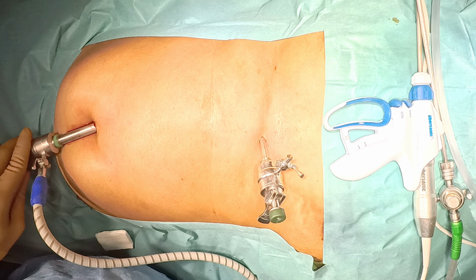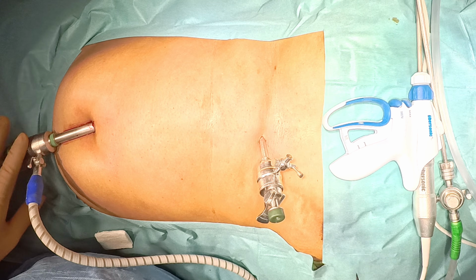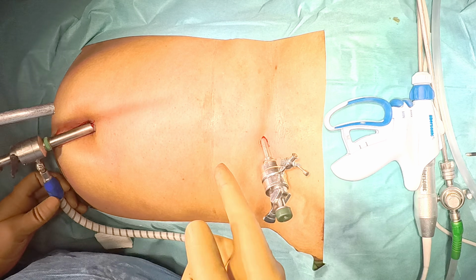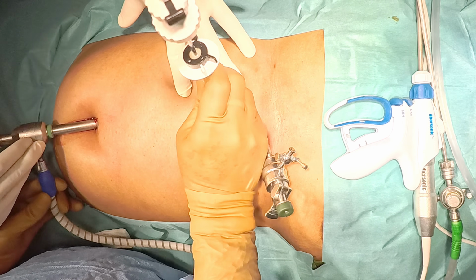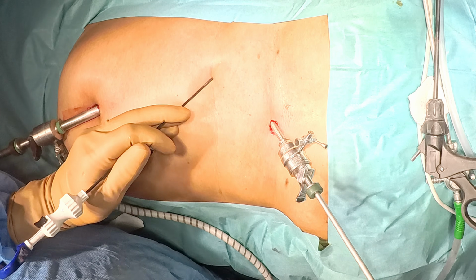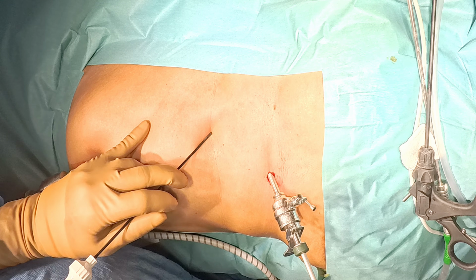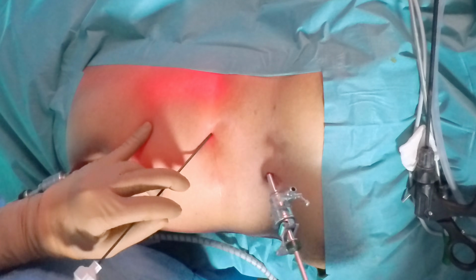So, this is diagnostic. Basically this third one is not a port, it is only a mini alligator. So, it is just a stab wound without any port. You can put the alligator inside, and that will be the left hand giving anterolateral or anteromedial traction. Now, head is up and right is up, the patient is tilted towards the left side, and now the surgery will start. So, we are not using a third and fourth port, we are using a Stryker mini alligator.